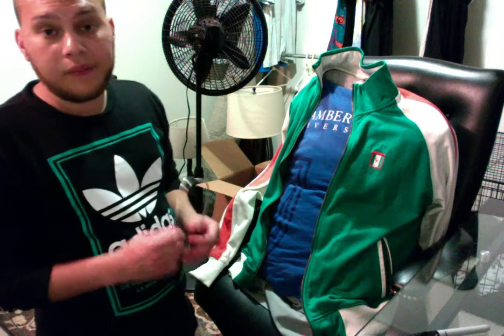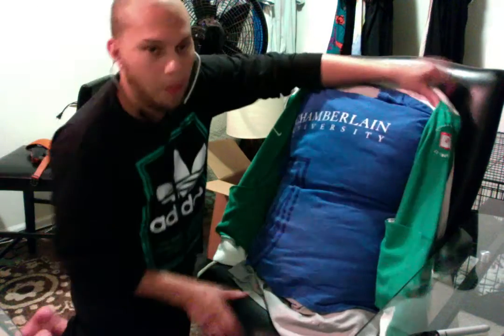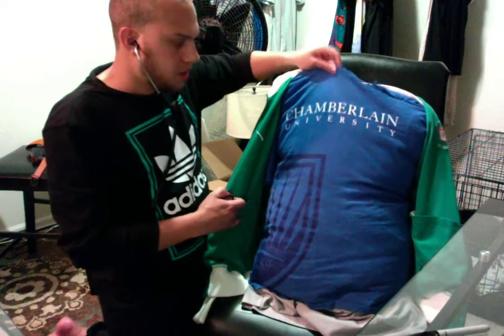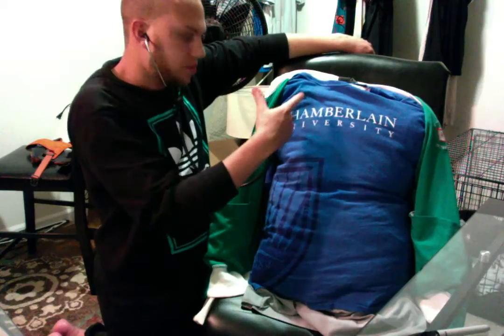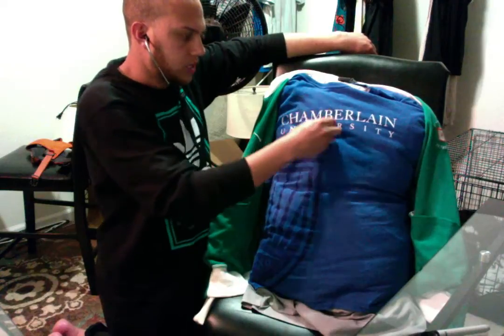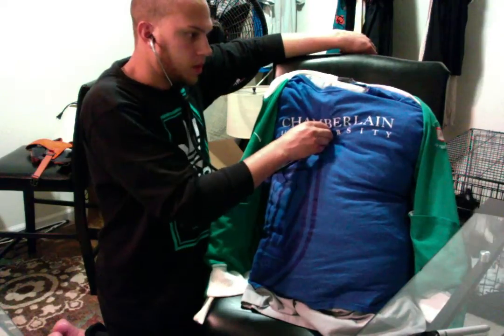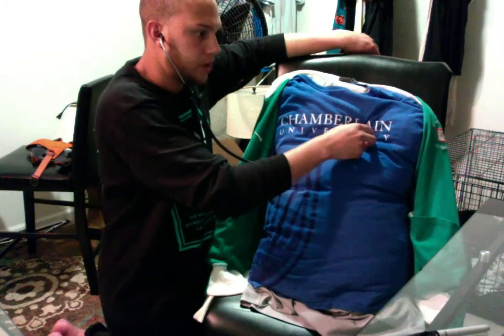Okay, so there are 5 separate places where we're going to listen on our patient here. I do this with the diaphragm first. Right side, second intercostal space, right next to the sternum. We're going to listen. It's going to be the aortic. Second intercostal on the left side, right next to the sternum.